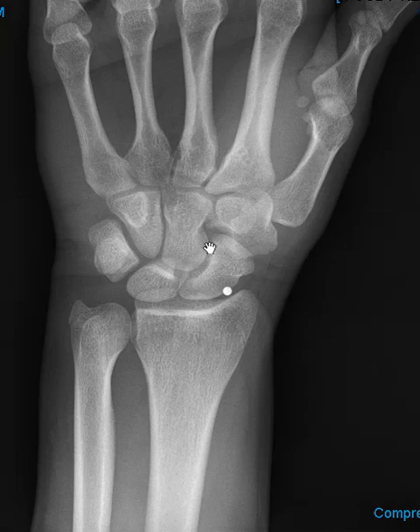We do an AP view of the wrist. We put the palm down, so this part of the wrist is poking up, and the palm is down. That will open up the dorsal part of the joint. We're going to aim about right here — oftentimes people will aim right here between the radius, scaphoid, and lunate bones. That's another good place to aim.